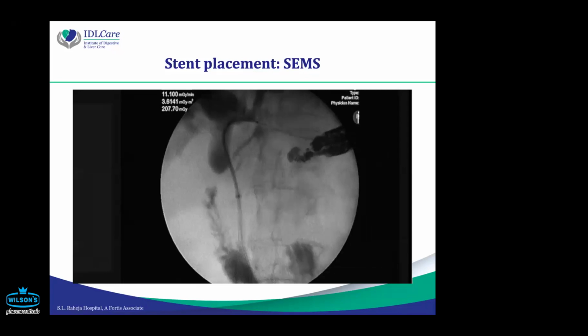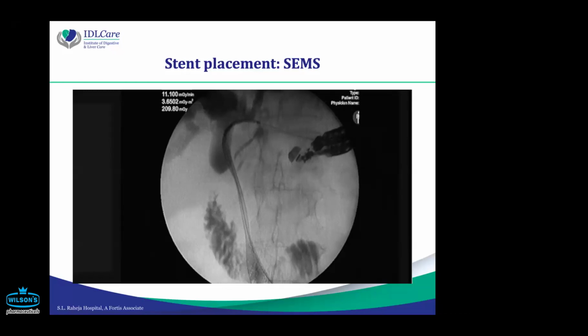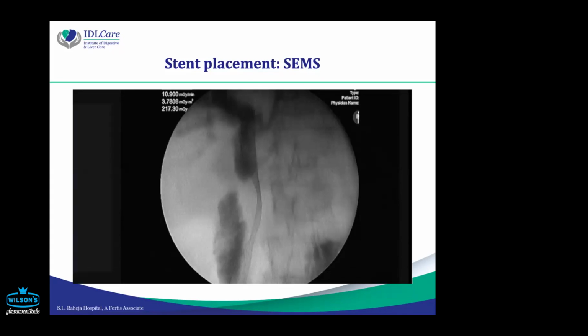You know, there is a point there. But most of the time, it is a straightforward deployment, just like ERCP. And some people will place a plastic stent after this between the stomach and the liver. I never do that because we haven't encountered any case of a major bile leak following antegrade procedure. So these are the technical details.